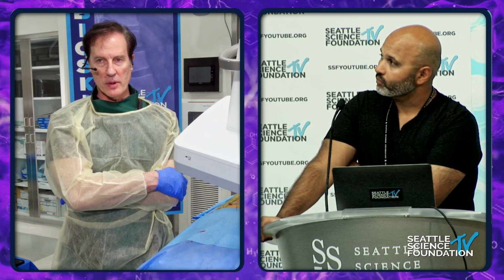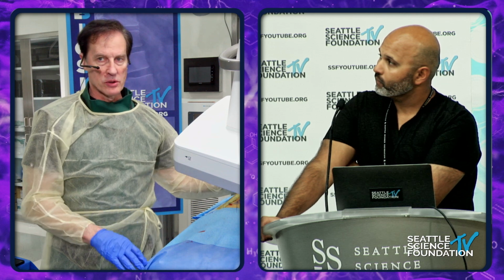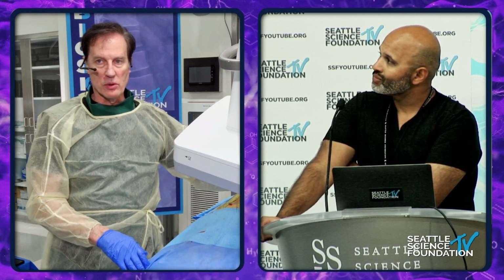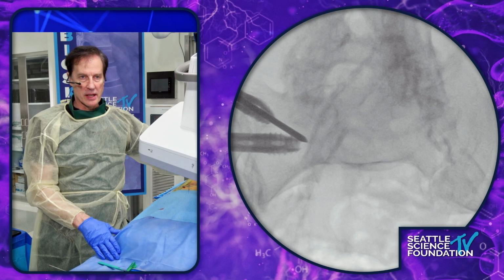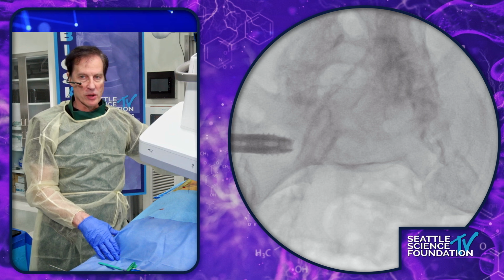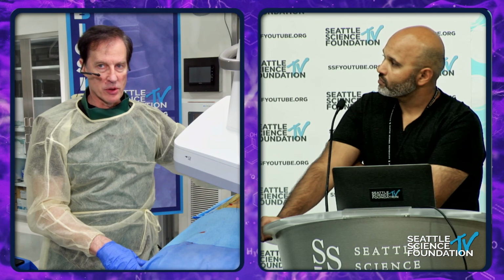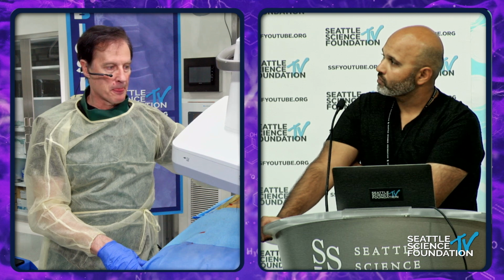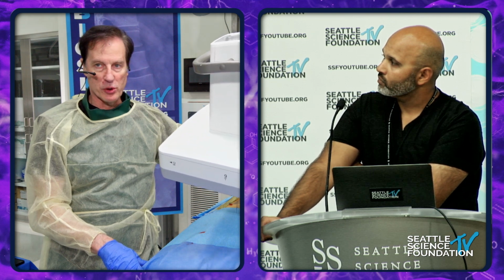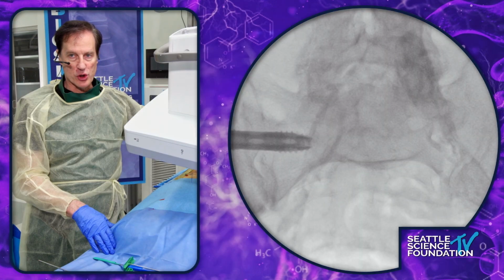So can you take a shot for me again? This is the contralateral pelvic inlet view, and I've taken the lateral, posterolateral implant out. You can see at the very bottom of that, that is the SI joint. And if we were to go a little bit, can you arc about 5 degrees toward me? The posterior inferior portion of that is more anteroposteriorly oriented, so you start to sharpen that up.